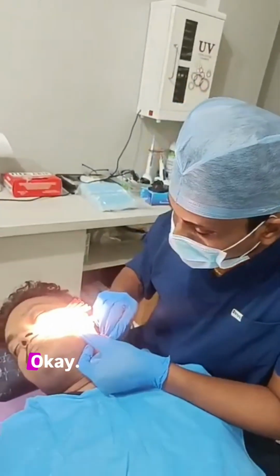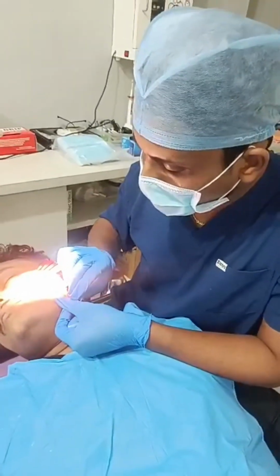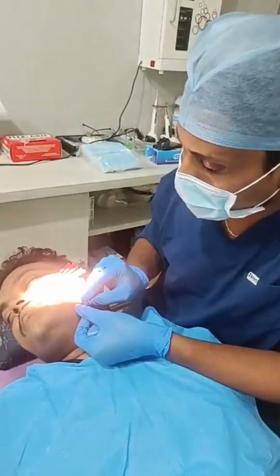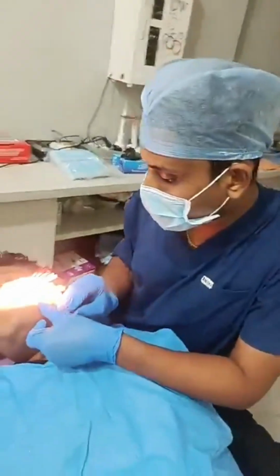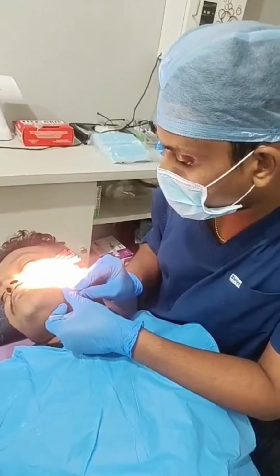Always make the tissue taut at the insertion point and then go below the subcuticular plane. Never go too superficial. Sometimes you will feel an obstruction, then change the angle slightly, because you have already inserted the previous threads, so slight obstruction might be there. Just change around the region. Over here I am going at a bit upward plane.